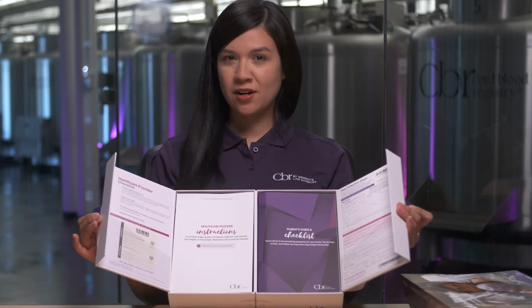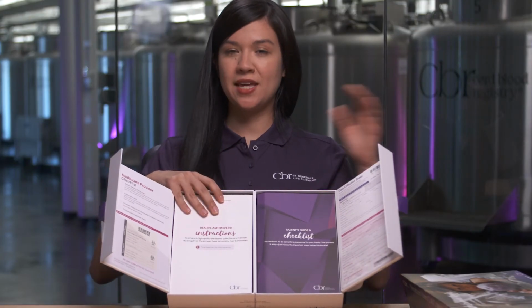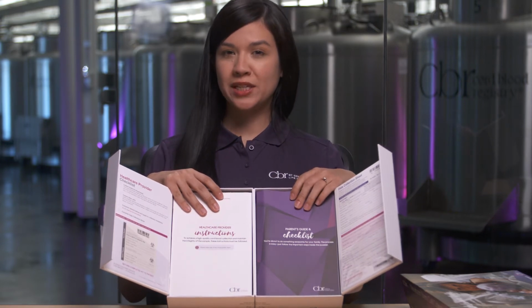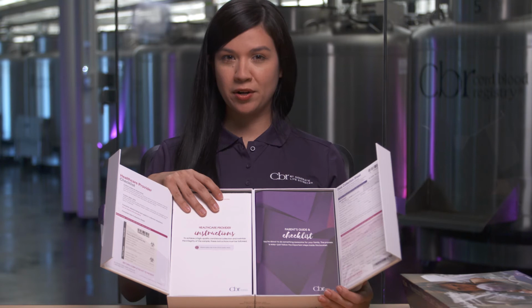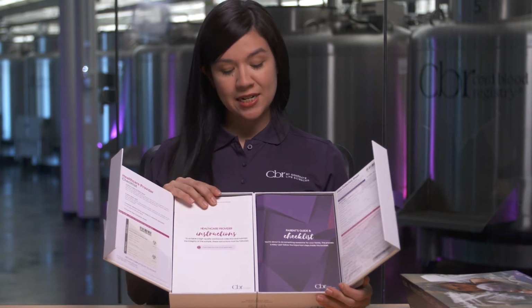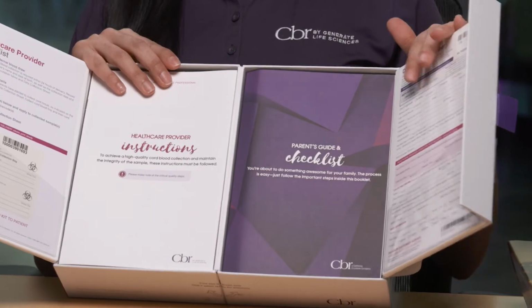Inside these doors are the healthcare provider instructions and the parent instructions. The parent instructions are for you. You should read this over and share it with your birthing partner because it has important information for the day of delivery. Next, look in the pocket on the right side.